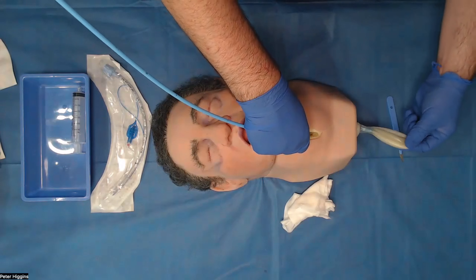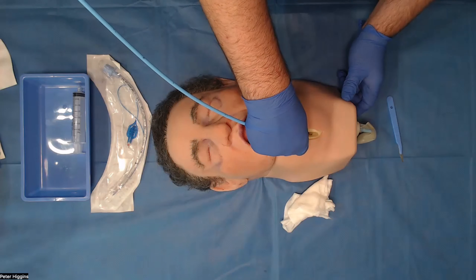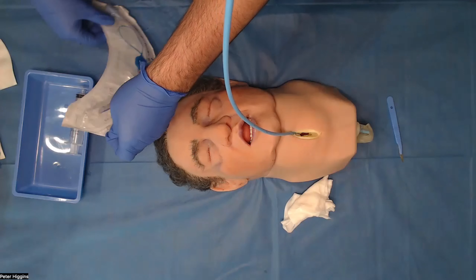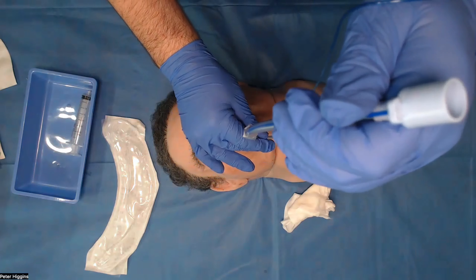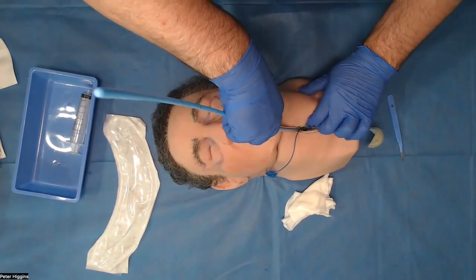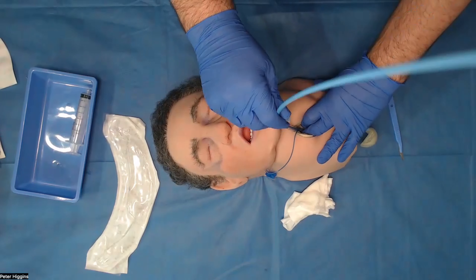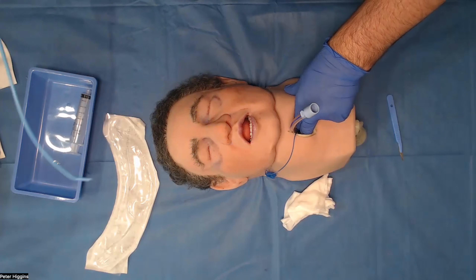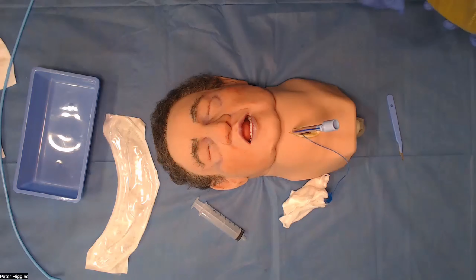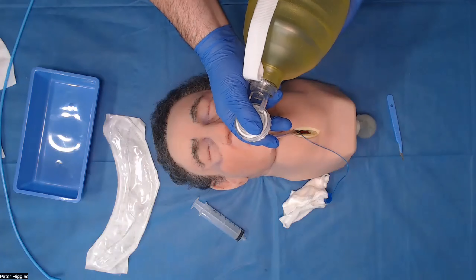You can get positive placement of your bougie by seeing through the balloon at the bottom here — you can just see the tip of the bougie come out of the bottom there. Now I will railroad my tube over the top. Tube is in the trachea; withdraw the bougie now. Inflate my cuff. Now I can ventilate my patient — you'll be able to see the balloon down there going up and down.